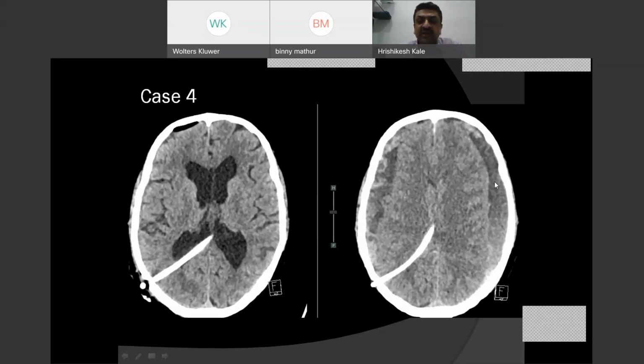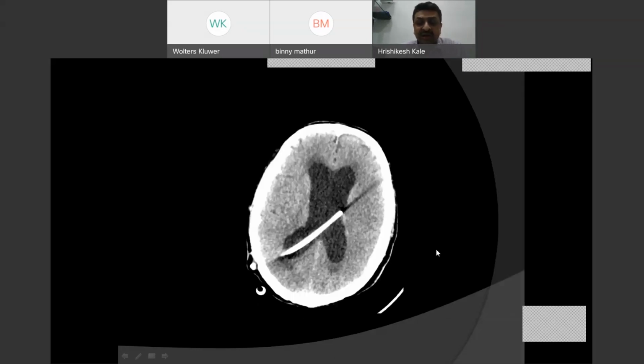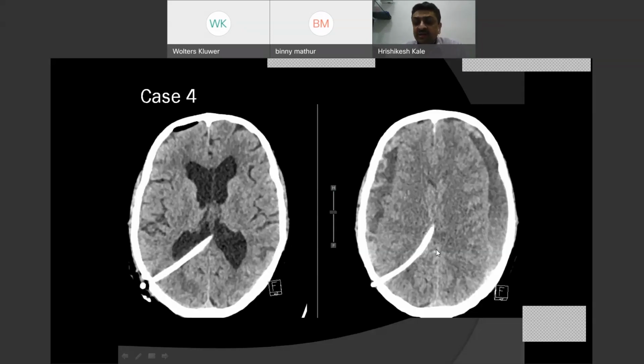And you can see he has bilateral subdural mixed density fluid collections, and the ventricles are almost completely effaced on this evaluation. So what do you think has happened? Basically, there is over drainage of CSF producing intracranial hypotension. This is the same picture that you see in SIH, with bilateral subdural collections and over drainage of CSF producing these findings.